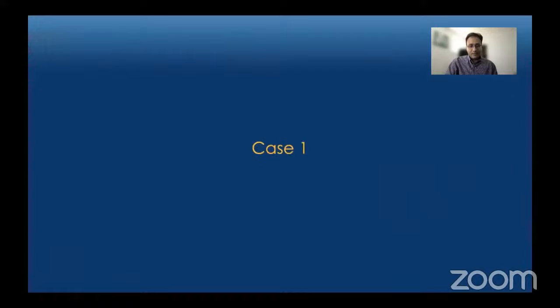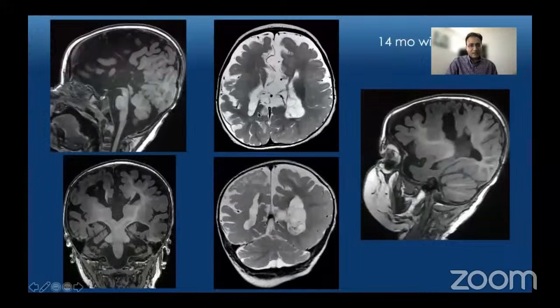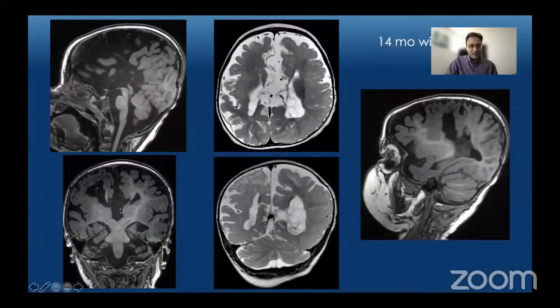The first case is a 15-month-old who presented with seizures. On the sagittal T1-weighted images we can see absence of the corpus callosum, and there are multiple sulci which radiate all the way up to the ventricular margins. On the coronal images there is absence of crossing fibers, abnormal orientation of the frontal horns, a high-riding and dilated third ventricle. Similarly on the axial T2-weighted images there is absence of crossing fibers in the midline with a prominent inter-hemispheric fissure.